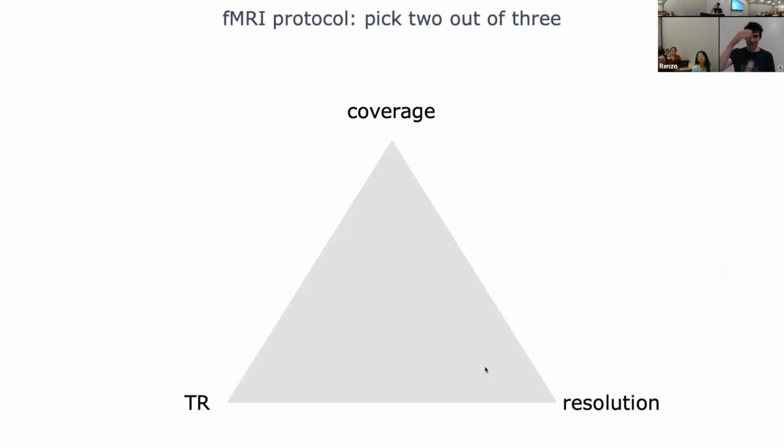As Tyler introduced in her two-dimensional space of scan time and image quality, this is basically a different spin on the same compromises. We can spend our time at the scanner in the encoding limited regime to get a lot of voxels that are very, very small, or we spend it to get a lot of voxels to cover a large area.